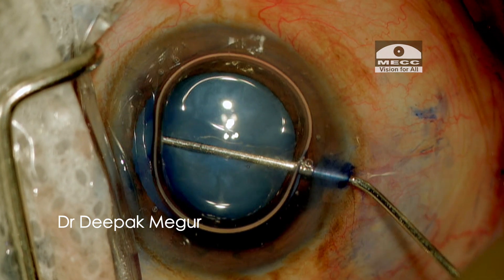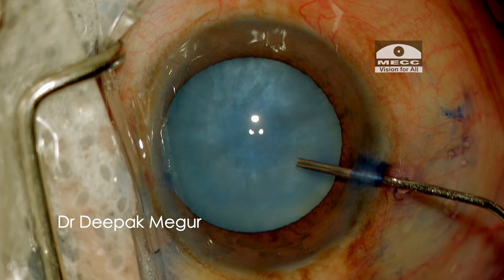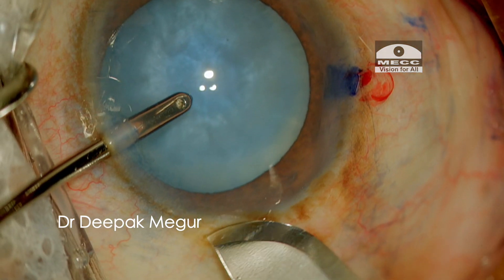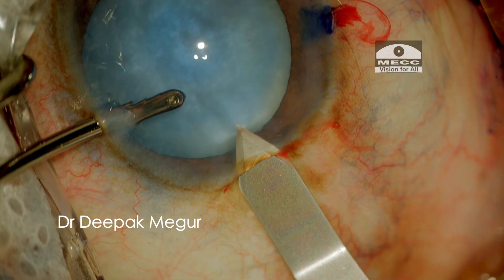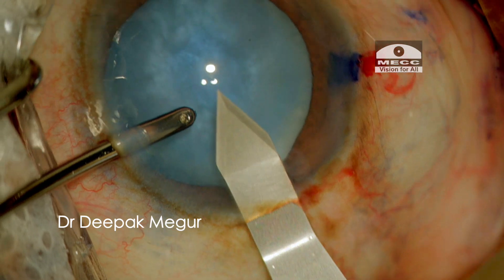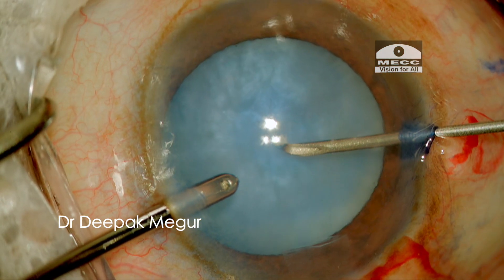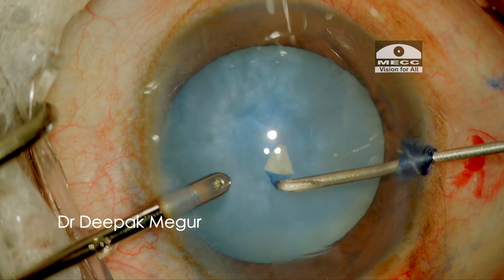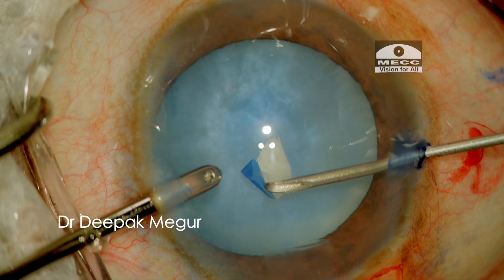After seeing the anterior capsule, I am injecting a dispersive OVD and my plan is the usual: to make a two-stage rhexis — initial small one, decompress the bag and then do a larger one. So I puncture the anterior capsule and try to raise a small flap, but suddenly I see that things are not under my control.